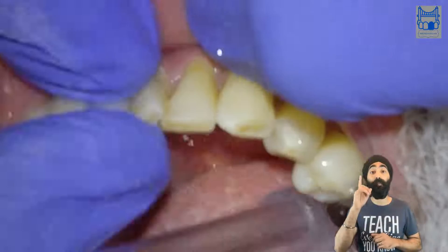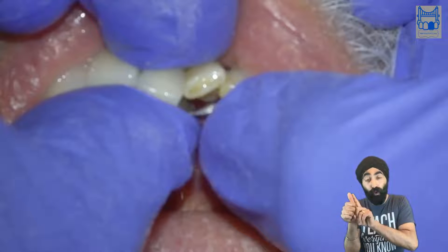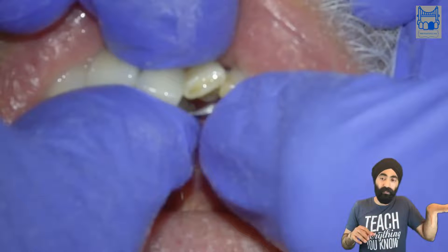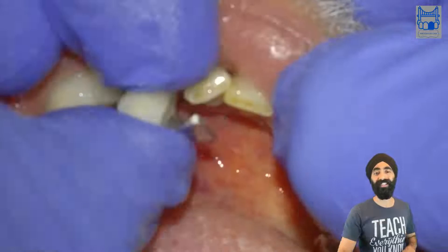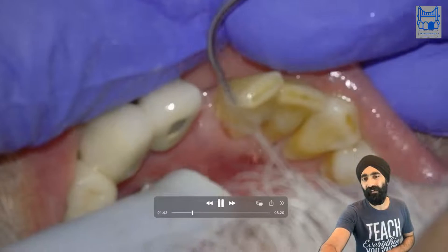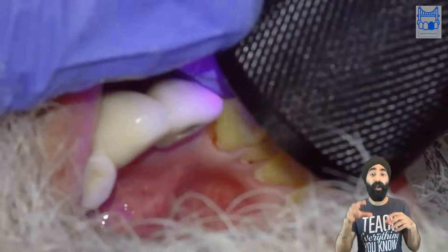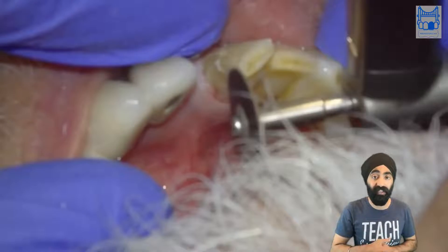I'm doing a rehearsal of the path of insertion and it's not quite seating well. It's really, really important to always try in and rehearse your resin bonded bridge — whether it's a re-cement or a de novo bridge. Here I'm not getting the feel that I need, so I know something's not quite right. I investigated and saw there is some cement there. I sometimes use a UV light to see where the cement is and why the bridge is not seating. And you do see the cement fluorescing with a UV torch.